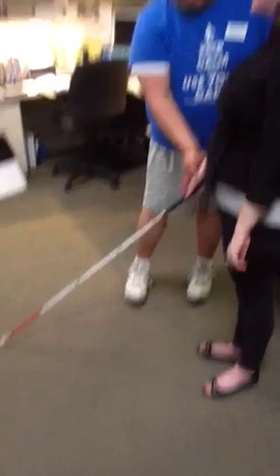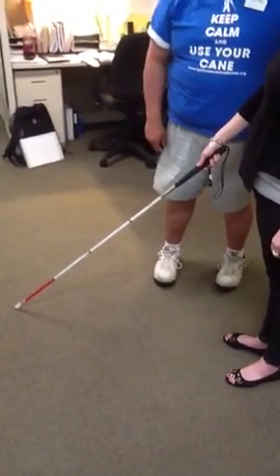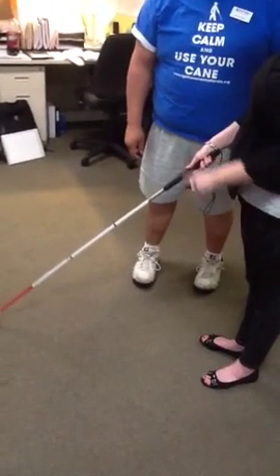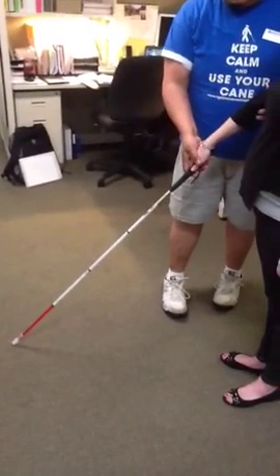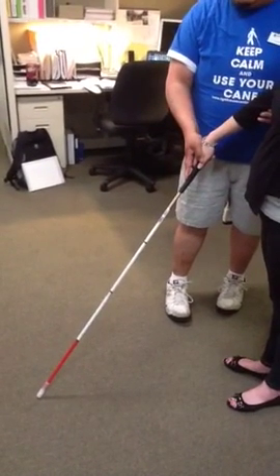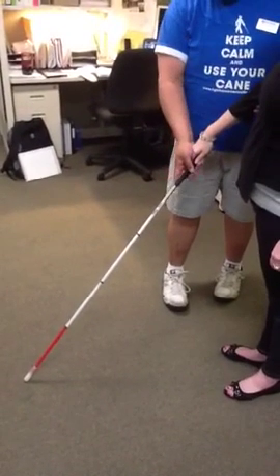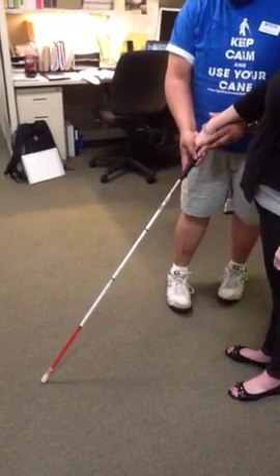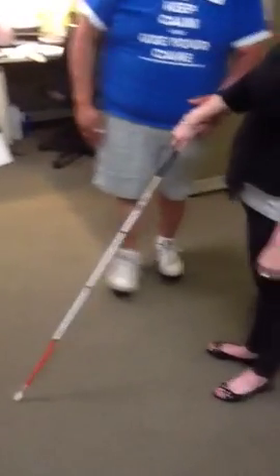Now, the diagonal technique, what we're going to do, which tip did you really like to use, or which grip? The thumb. What we're going to do with the thumb is we're going to turn it inward, and we're just going to put it diagonal, just like so. Your arm is straight, your hand is turned, and the cane is diagonally in front of you.